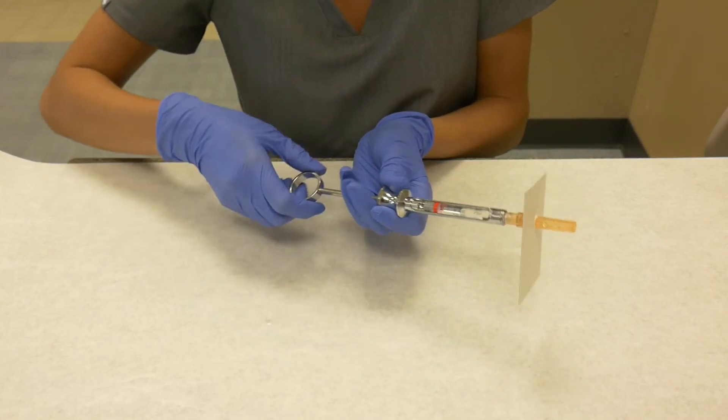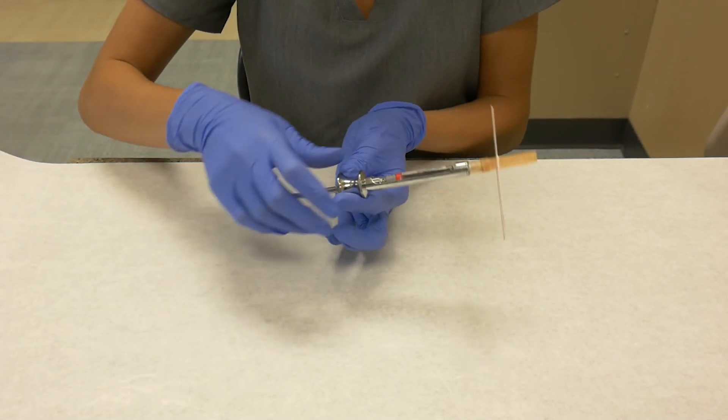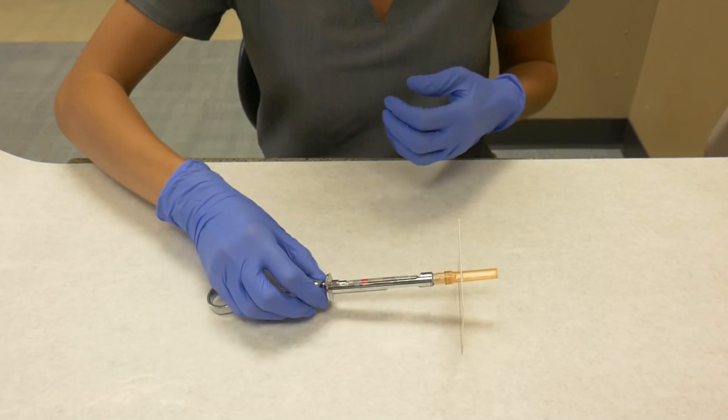Slide the cartridge forward to engage the other side of the needle, and give a few taps on the thumb ring in order to engage the harpoon into the rubber stopper of the cartridge.